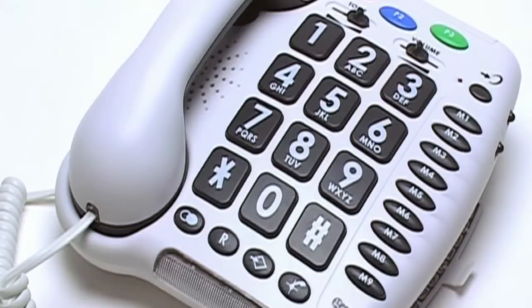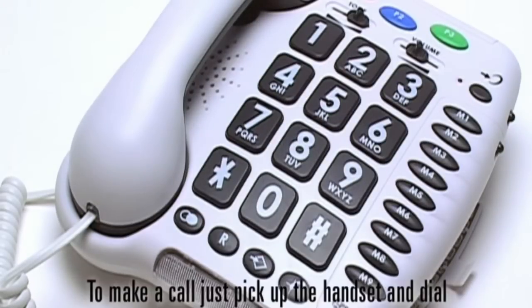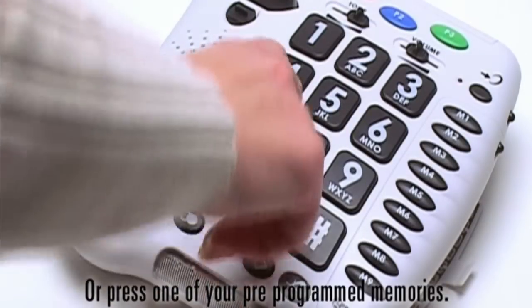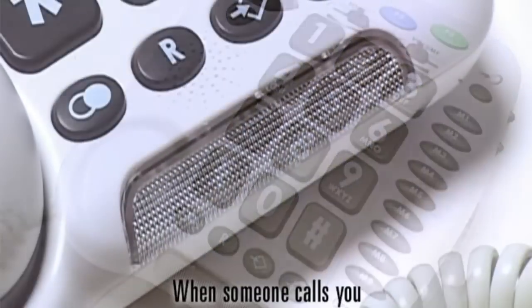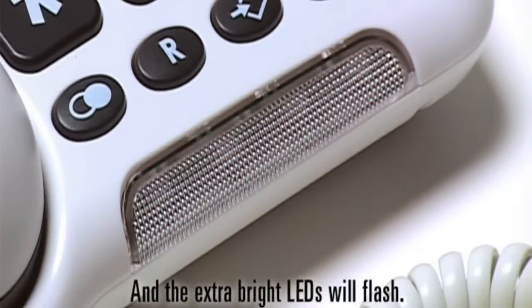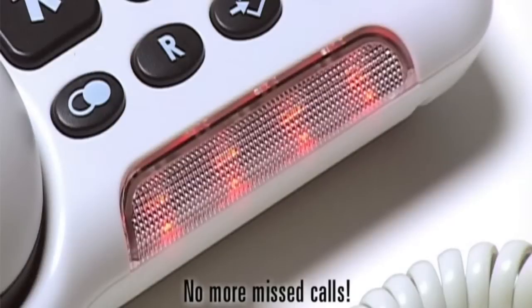Once your phone is plugged in, you are ready to enjoy hearing your loved ones again. To make a call, just pick up the handset and dial or press one of your pre-programmed memories. When someone calls you, the CL100 will ring and the extra bright LEDs will flash — no more missed calls.